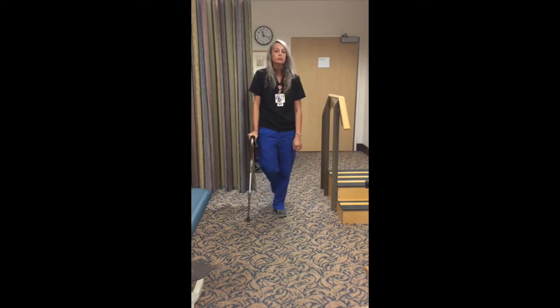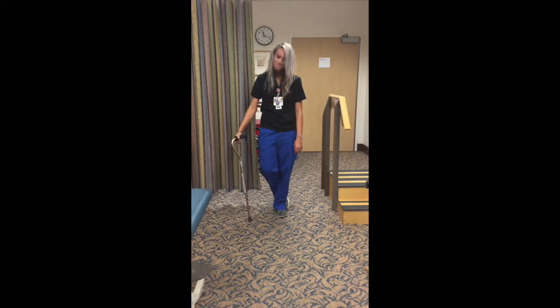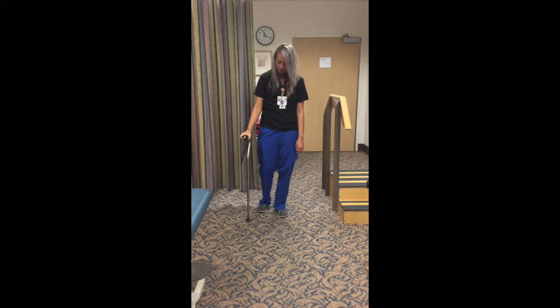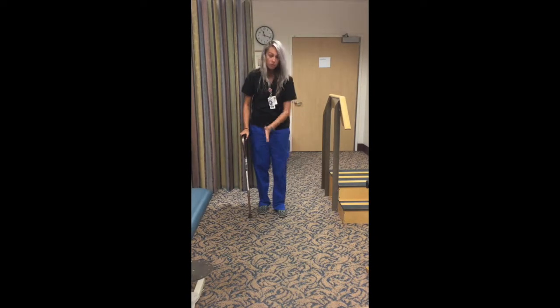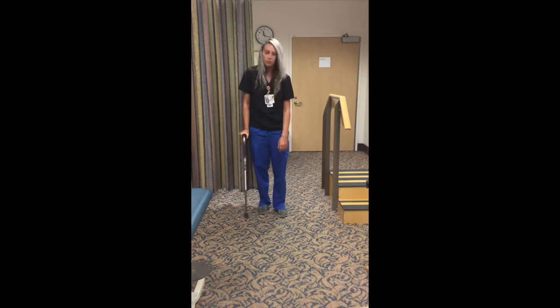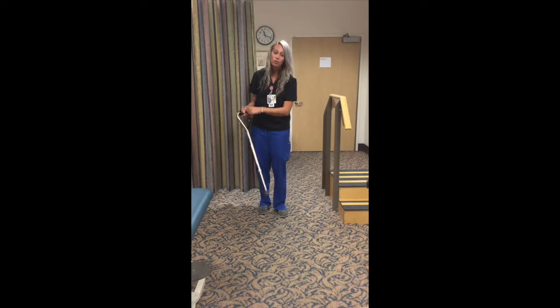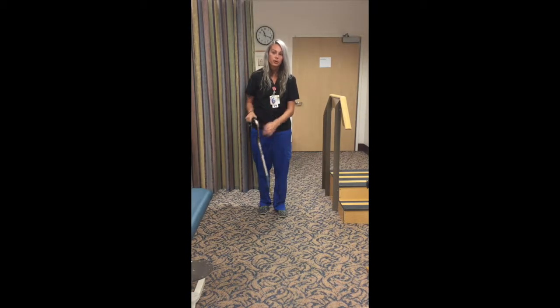And again, very detailed. So the cane has a little hook in it, and which way do you put the hook? So, I mean, I've seen patients walk with it this way, but it's not ergonomic and it doesn't really give you support here. So if you're facing the hook away from you, then it fits very well in your hand and it actually gives you a little bit more support there. So there are canes that don't have a bend in it at all, it's just a straight cane, and those are fine too as long as the handle fits in your hand okay.